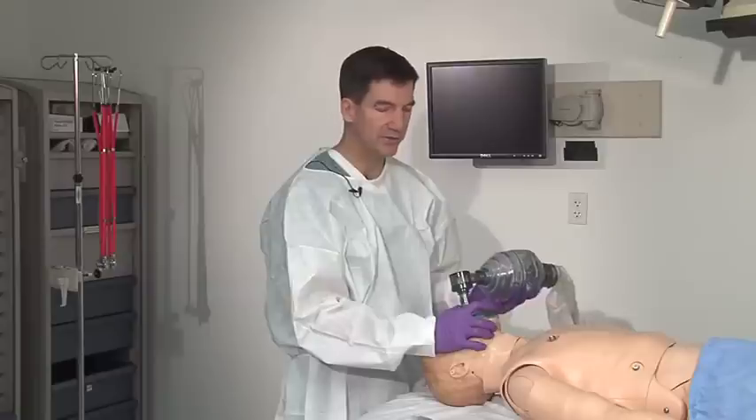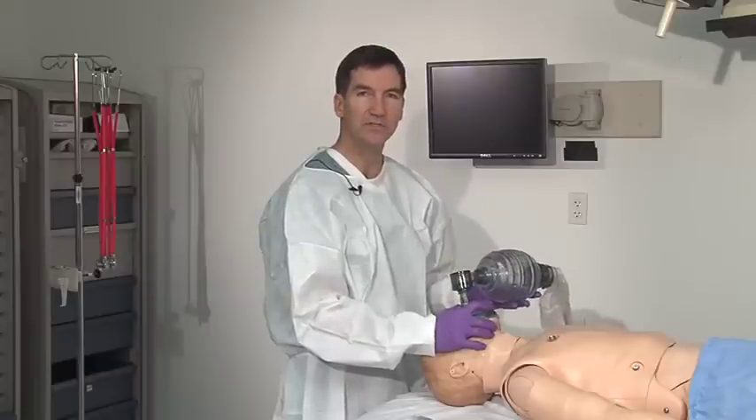Ideally, we'd have pulse oximetry on at the same time, so I'd want to watch to see an increase in the pulse oximetry. Physically, this is a little bit of a difficult task. It is best done if an assistant can provide another pair of hands to do the bagging while one person holds the mask in place.